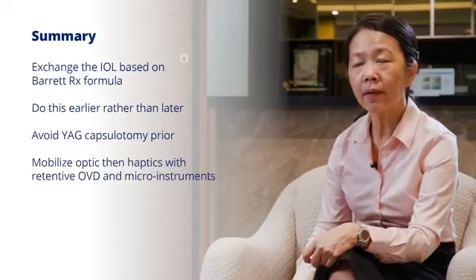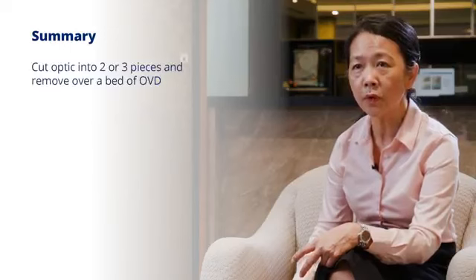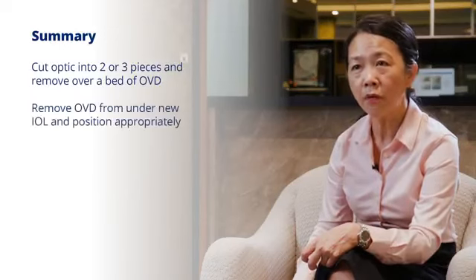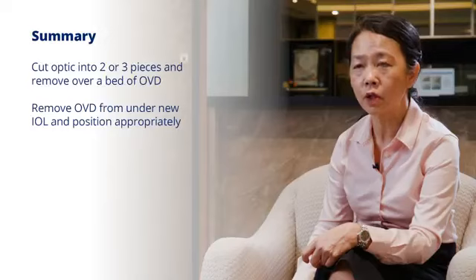Mobilize the optic followed by the haptics with retentive viscoelastic and micro instruments. Cut the optic into 2 or 3 pieces. This is really the simplest technique. And then you remove it over a bed of viscoelastic. Remove the viscoelastic from under the new IOL and position appropriately.